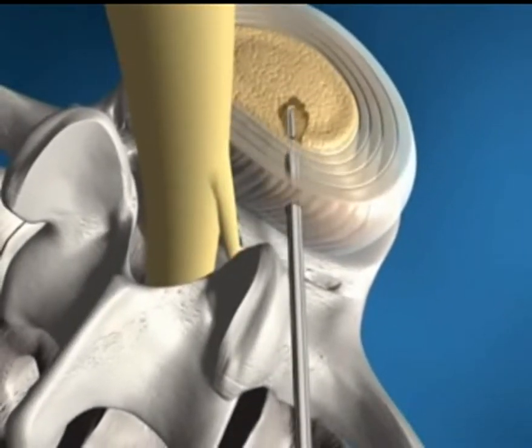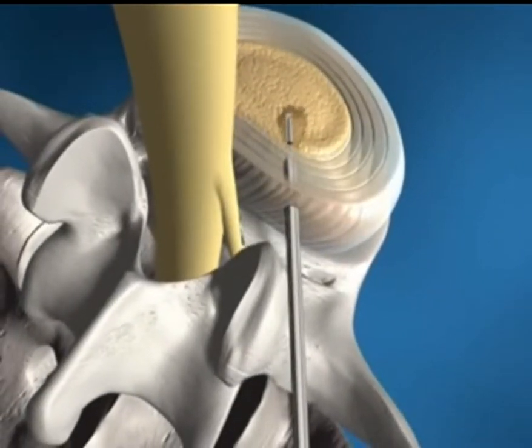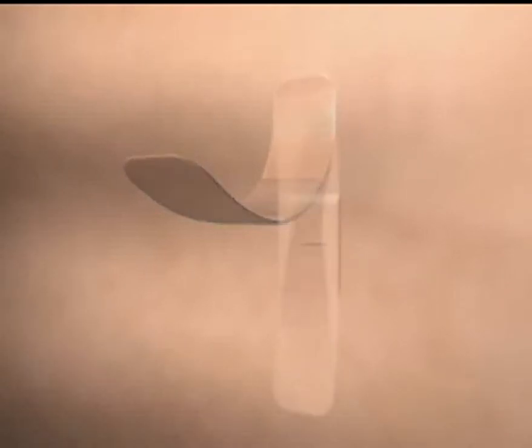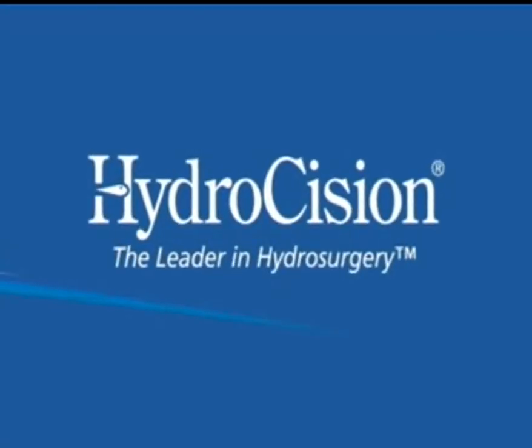The disc is decompressed, relieving nerve root impingement and pain. The Hydrocision Hydrodiscectomy procedure can be accomplished in an outpatient setting under local anesthesia and is typically completed within 30 minutes.